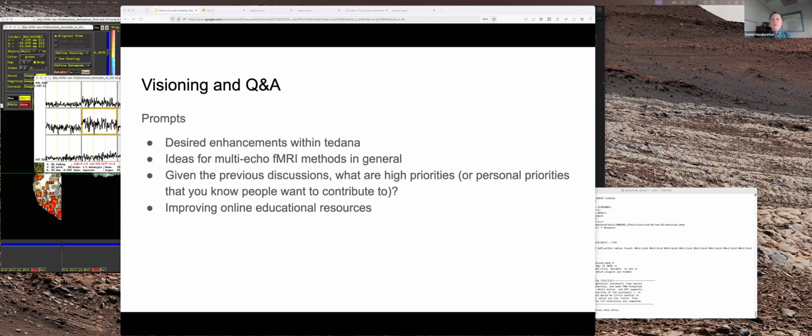It's going to hit a lot of the code, but the one open question is, because we're regressing things out, we kind of have to zero out everything censored at that point to keep the time structure, unless people have other ideas of how to interpolate areas censored out, because we don't want people to not denoise time points within tedana and then use that stuff later. Can you use the pointwise censoring, just spike regressors? Maybe I should talk more with you about the different ways you've approached that.